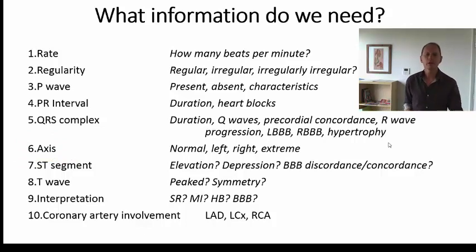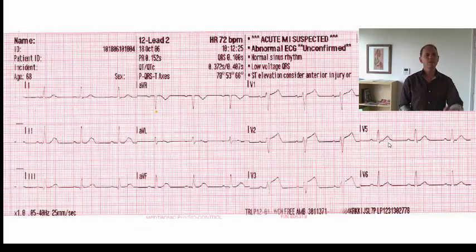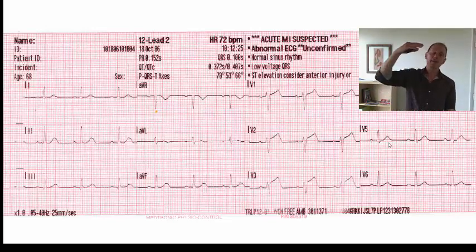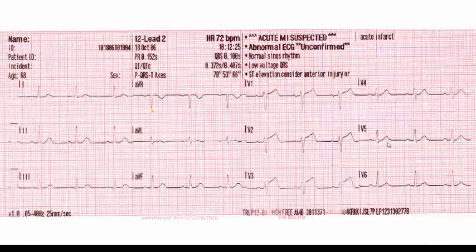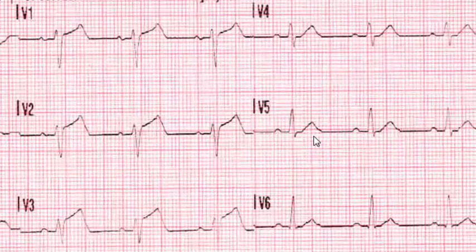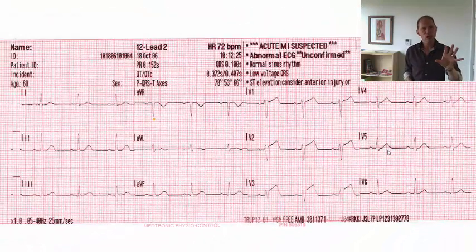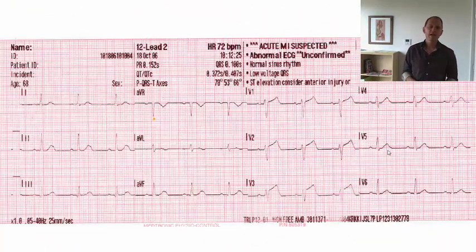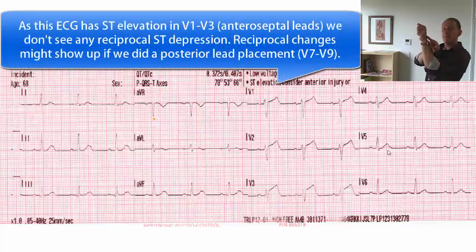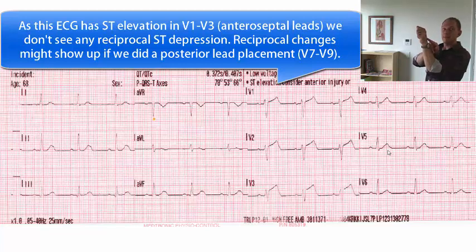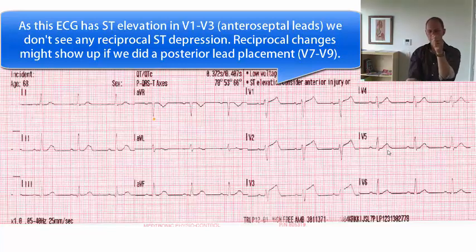Now let's look at our ST segment — that's the period from the J point, or the end of the QRS complex, to the T wave. We're looking at things like ST elevation, which is a really important one to look for. We see ST elevation here in this ECG in a little bit of lead V1, but certainly in V2 and V3. Is there ST depression? ST depression typically is an ischemic change, but it could also be a reciprocal change — you might have ST elevation or an infarction in one portion of the heart, but the lead looking at the opposite side will have a mirror image, which is ST depression. So you might have elevation one side and depression the other.